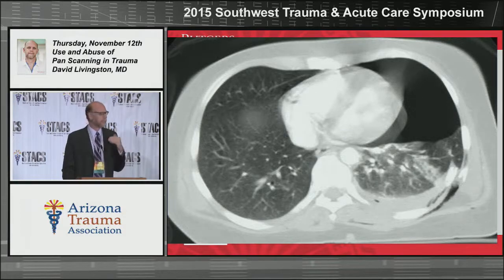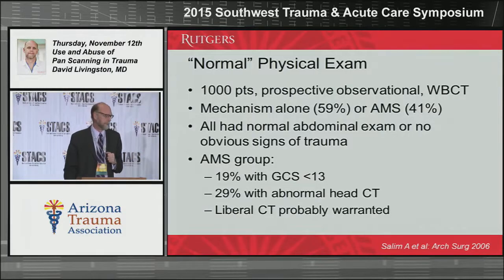So the chest x-ray will change, chest CT can significantly change your management. It surely changed Ms. Velez's management, okay? Well, what about your normal physical exam? Well, again, I'm old and ornery, and I've taken care of a lot of people who have a normal physical exam, and when I examine them, lo and behold, the exam's not quite normal, but that's another thing.